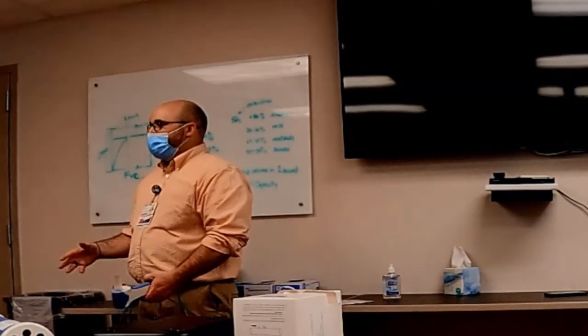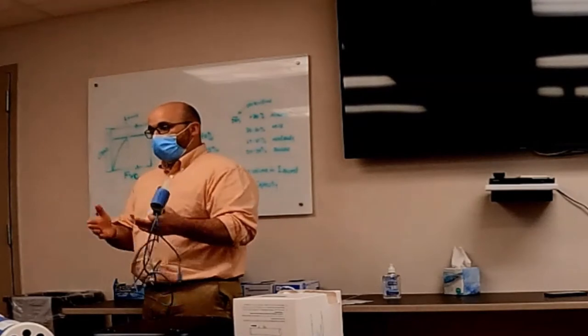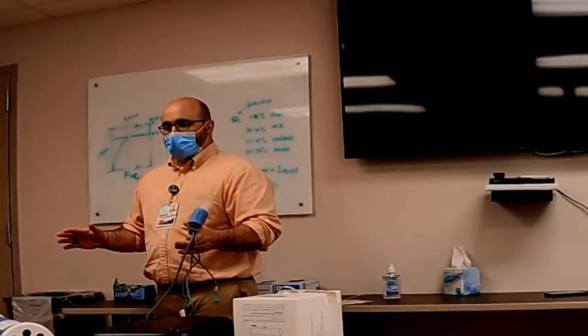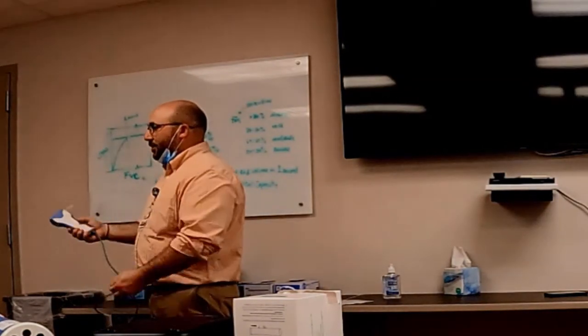Just taking one at a time doesn't do much because heart rates can be different. But if you have something to compare it to, like a year ago they had this for their spirometry, and now they have this for their spirometry, we can say same, better, or worse. Is the medication working? Well, what's the change in their spirometry? Okay. So that's why I really see that, and I was saying that doing this in the office and doing training for this is so important, and I applaud you guys for coming to this, because you will know more than 90% of people that are doing this in the office. I've seen crazy stuff. It's just like one of those tasks kind of thing, right? Like, okay, yeah, this task, check, do spirometry.